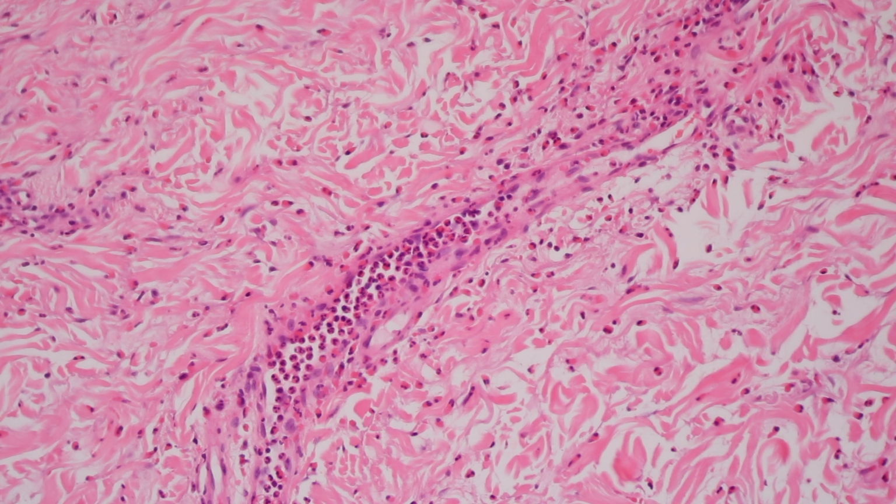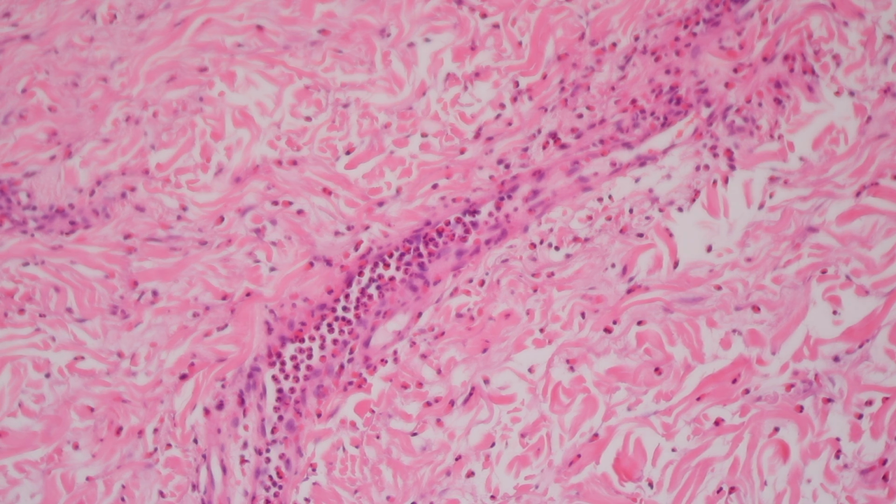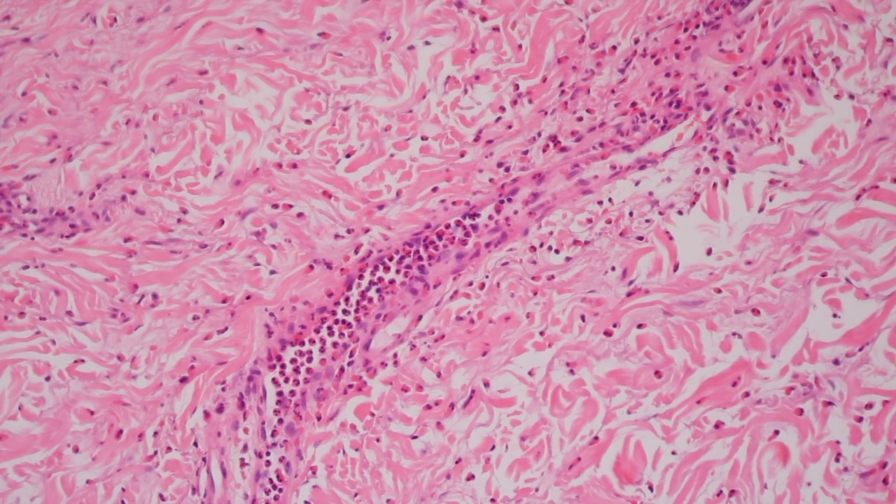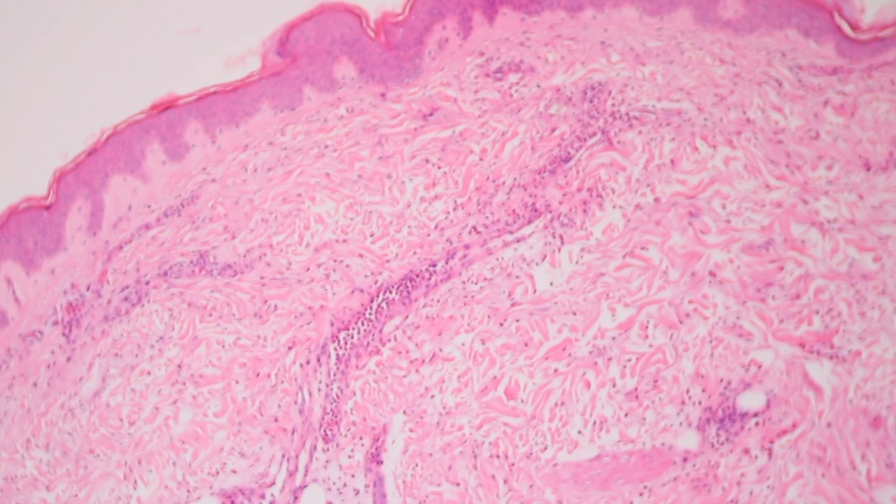We don't have them in this case, unfortunately, but when you see those, that's one really good sign for Churg-Strauss. But in fact, the couple of cases I've seen of Churg-Strauss most recently did not have anything like that. It just looked like LCV with lots of eosinophils, or in this case, the vasculitis is really not, you can barely even see any vascular damage, but tons of eosinophils. And a clinical workup for Churg-Strauss is worthwhile. I think the most recent one had good LCV, but it went deep into the dermis and had a lot of eosinophils. I don't have that slide handy for some reason, but that one I mentioned to the dermatologist to do further workup, and in fact they did find Churg-Strauss after they worked the patient up. So it's good to make those kinds of comments. Sometimes that can really help the dermatologist figure out how to better manage the patient.